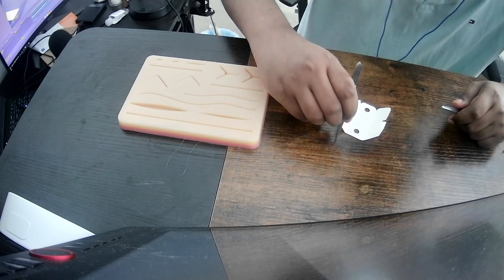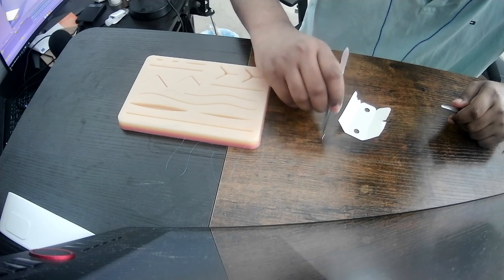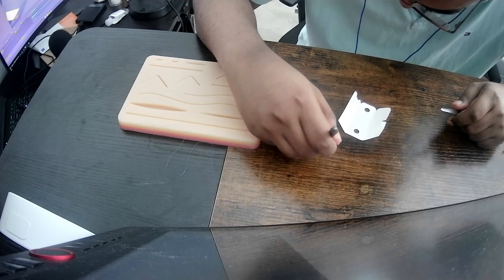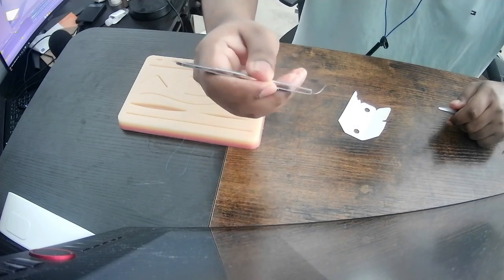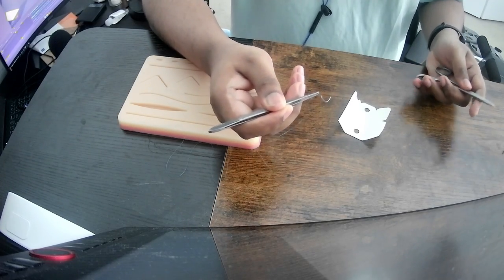There has to be a simpler way. I feel like I'm complicating this by not using the forceps, there has to be something easier. Just angle it, pick it up. I guess that's good enough, not too rough. Or just hold the suture, I guess.